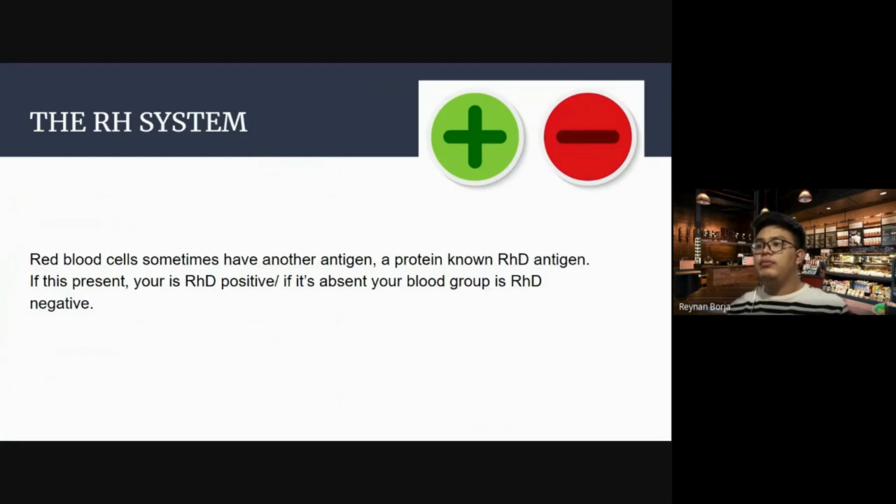Okay, remember this one. ABO Rh grouping is magkaibang system, magkaibang group. Kaya ginugrupo natin sila in order to determine a certain blood group, your ABO Rh blood group. So pinagsama natin si ABO system and your RH system. Okay? Huwag kalimutan kung bakit grouping siya. O simply as typing. Dalawang system pinaggrupo mo, pinagsama mo. Kaya ABO Rh grouping. So that's the technical term and that's the parang medtech terminology. Huwag tayong maggamit ng layman's term.